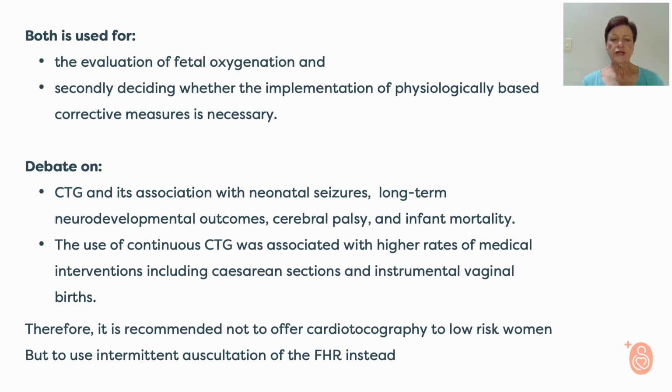The use of continuous CTG was associated, and there's a lot of evidence for that, with higher rates of medical interventions, specifically cesarean sections and also instrumental vaginal births. Therefore, it's very important to use the cardiotachography very wisely, to really decide whether it's necessary or whether it's not necessary.